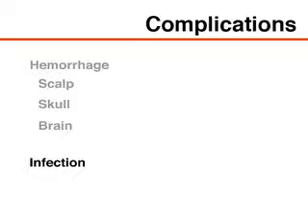Infection is a rare but serious late complication. Ensure adequate preparation and meticulous aseptic technique. Avoid handling the tip of the ICP sensor. The use of periprocedural antibiotic agents may be considered, but follow local guidelines if you decide to administer them. CT of the head, with and without the administration of contrast material, may be requested, and a cerebrospinal fluid sample may be obtained if there is concern about intracranial abscess or ventriculitis.